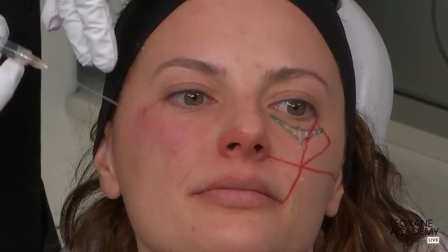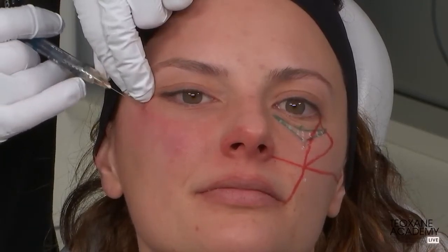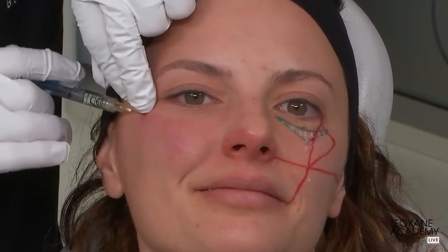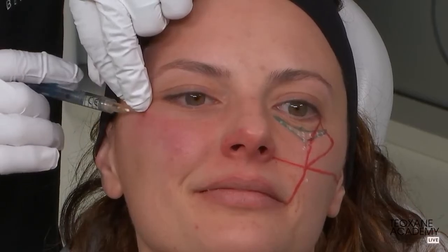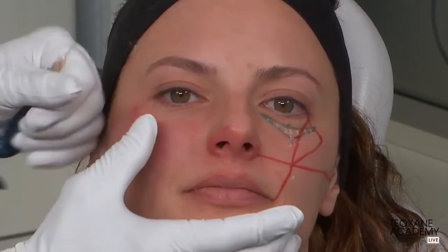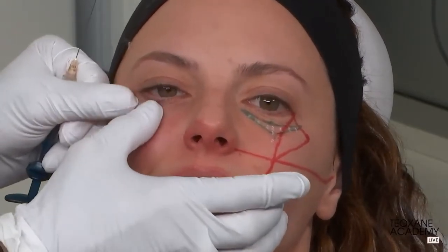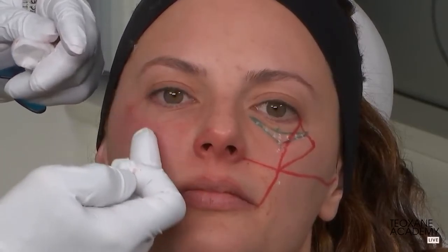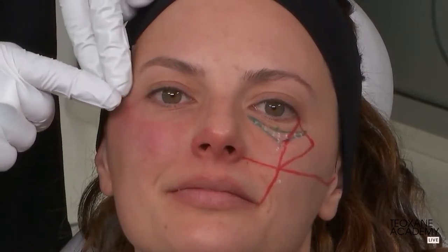Like it's almost, Francesco, it's almost like a crisscross technique. Exactly. It's like a crisscross technique with some lines perpendicular to the other one. The one is RHA4 and the other one is Redensity 2. Exactly. Patrick, you have completely grasped the sense of this. In the first case, I passed the orbital retaining ligament coming from down below and going up. In the second case, I'm passing the orbital retaining ligament and the tear trough ligament the other way.